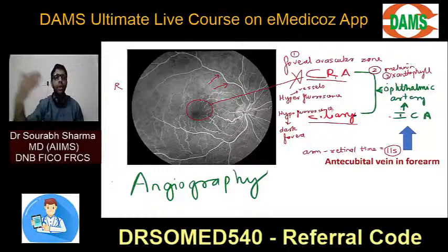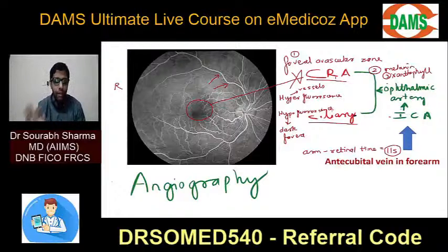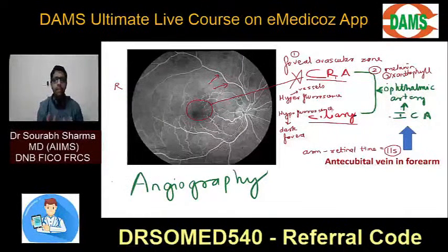That is why the choroid dye is not visible. So it is blocked hypofluorescence. That is the reason why the fovea is hypofluorescent on angiography: because of the foveal avascular zone, xanthophyll pigments and melanin pigments. So this is, my dear friends, your normal angiography.